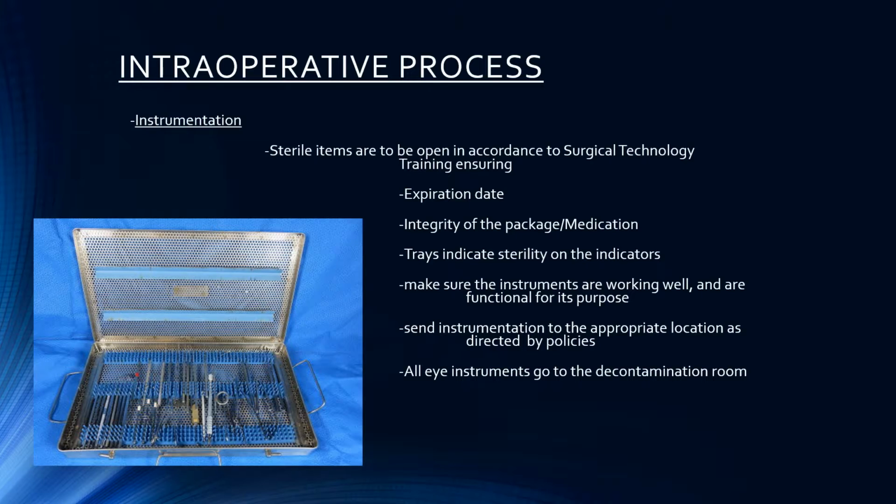Sometimes you may look at, I'll give you a perfect example. Sinskis are notorious for being bent. A Sinski is a tool. It looks like a little pick with a right angle at the tip. They can get caught in between the tray itself when it gets closed, and so it gets bent.